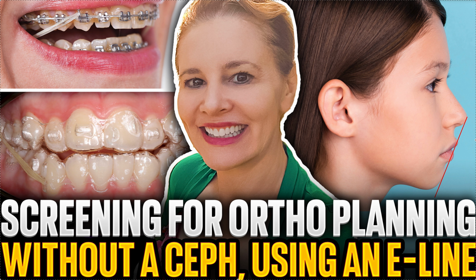But for those of you who do not have a Ceph arm or a giant CBCT where you can extract a Ceph, there are other options. There's always workarounds unless you're in the tiniest town in the middle of nowhere. As long as there's an oral surgeon or an endodontist or a periodontist, even if you don't have a radiology clinic or a university, there's usually a way to get a Ceph. Now, I'm not saying it's free, but there's usually a way to get one.